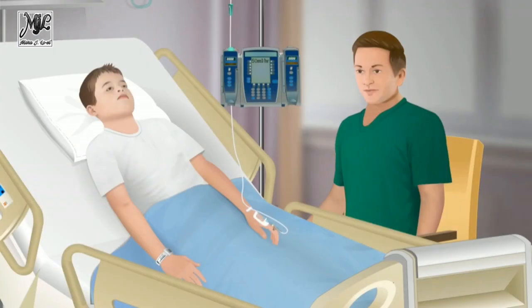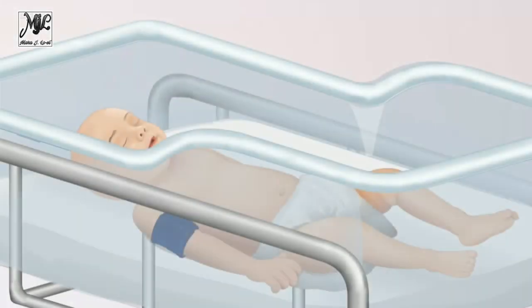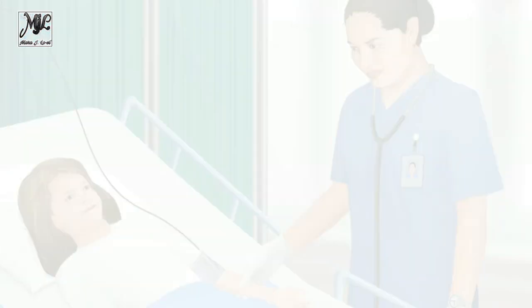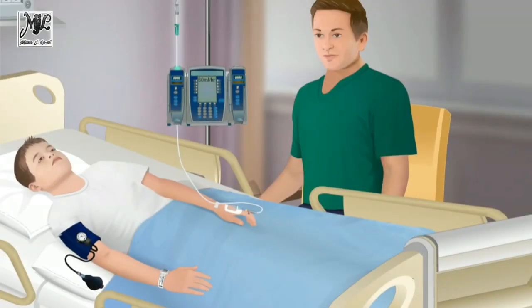Place a child in a sitting position. Place an infant in the supine position. Keep a child who is unable to sit up for BP measurement recumbent, and keep a child who is critically ill in a position that maintains hemodynamic stability. When taking a BP measurement in a child who is supine, support the arm on a pillow to ensure it is at the level of the heart.